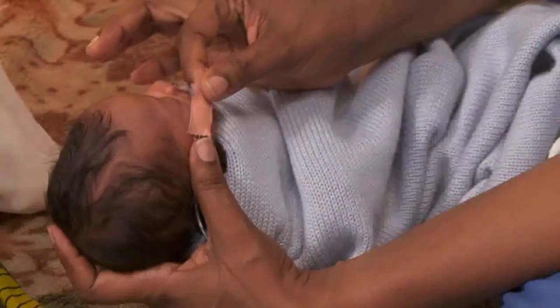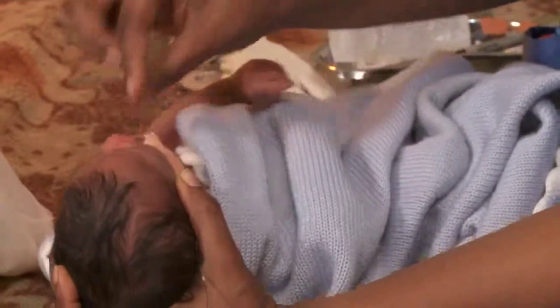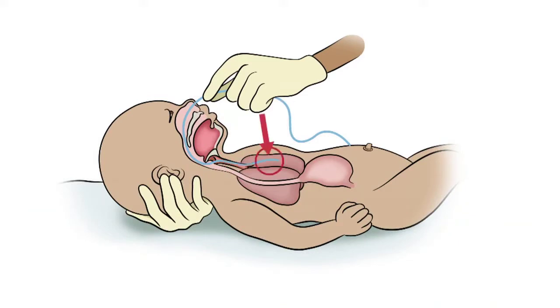The tube is uncomfortable for the baby as it's inserted, but painless once it's in place. Never force the tube. If it doesn't slide easily, stop and try the other nostril or the mouth. Very rarely the tube may try to go into the trachea leading to the lungs. This is rare but serious. A feeding that goes into the lungs can possibly be fatal.